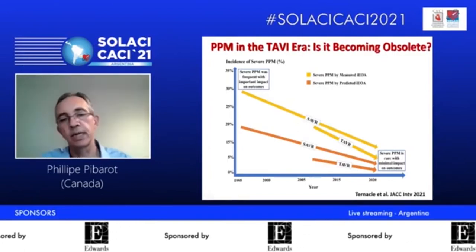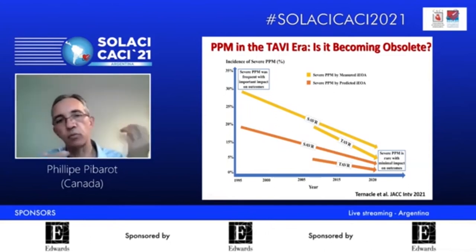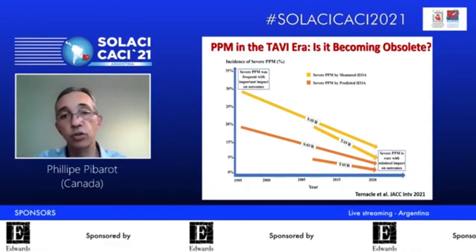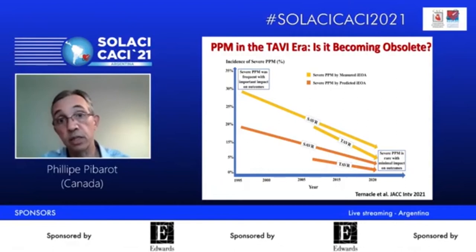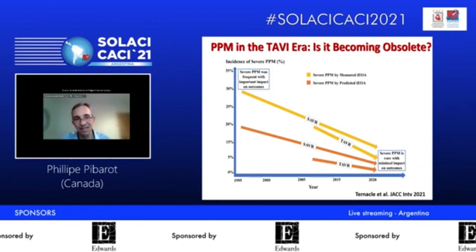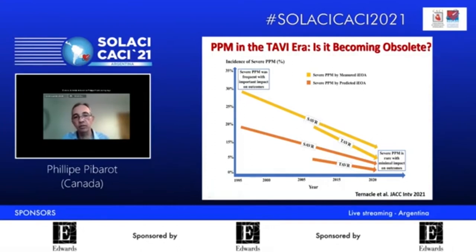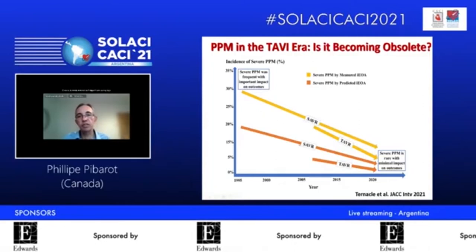And this is why, in a recent editorial, I put these slides together and said, with the improvement in the hemodynamic performance of the surgical bioprosthetic valve, and with the introduction of TAVR that has much less PPM, my hope, and I think it's becoming a reality, is that mismatch will become obsolete soon and we'll not have to discuss this topic. But I think we are not yet there.